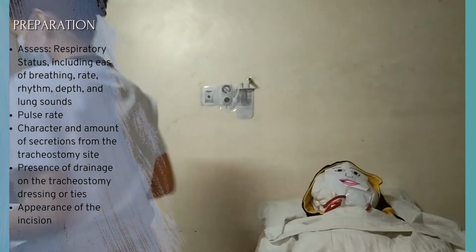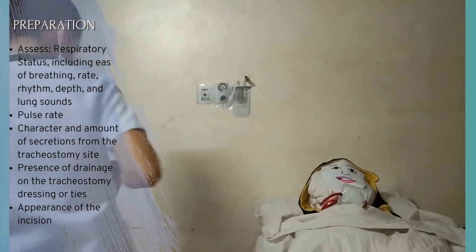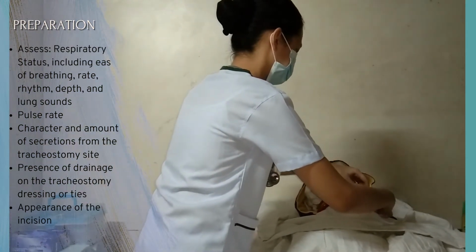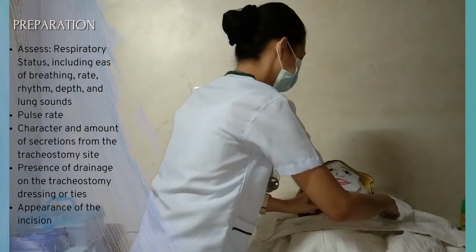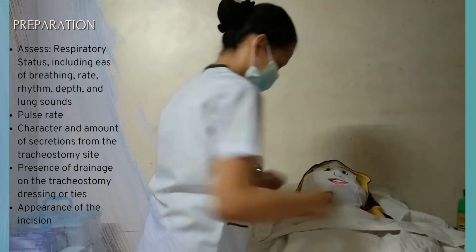First, as soon as you enter the room, you have to assess the patient. Assess the respiratory status including ease of breathing, rate, rhythm, depth, and lung sounds. This is to observe for signs and symptoms of complication. Measure the pulse rate. This is to know if the client receives enough amount of oxygen.